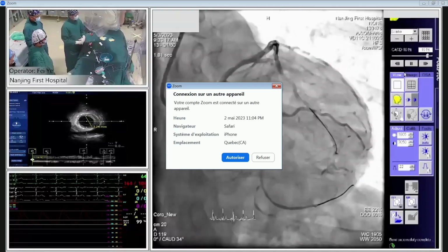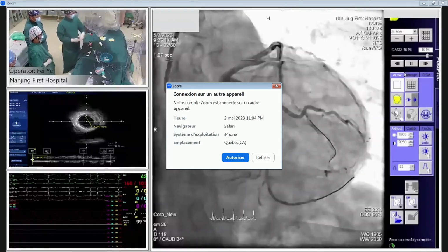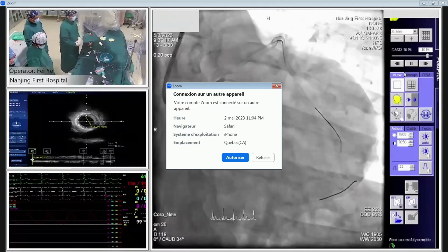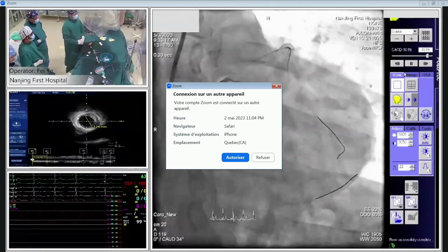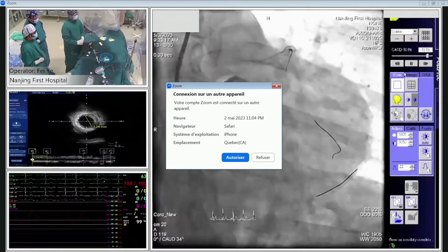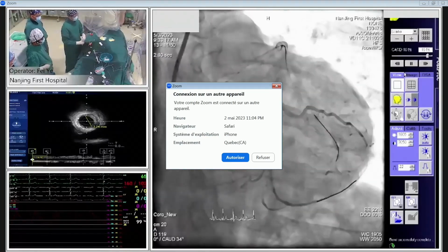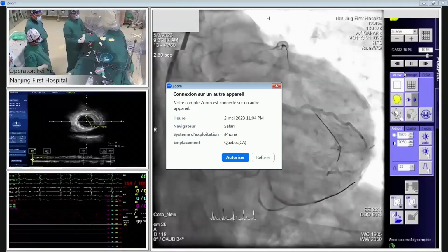That's very interesting. After we pre-dilate the lesion, we find another side branch there. This branch is not so small, and it also supplies a very distal area. According to the length of the side branch, it's not a small side branch. Will you save this side branch with a wire? Yes, and it's very important. Another question: we find another bifurcation lesion after we open the CTO lesion.